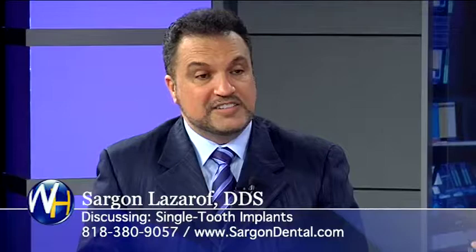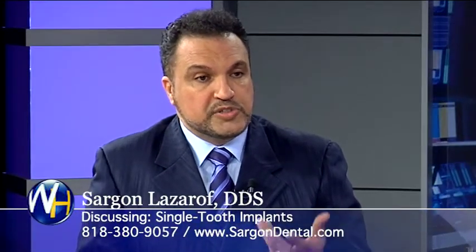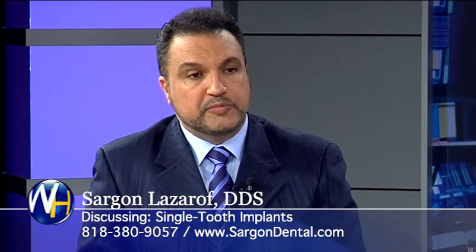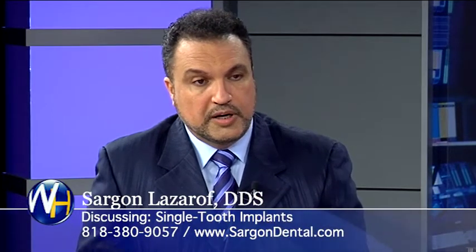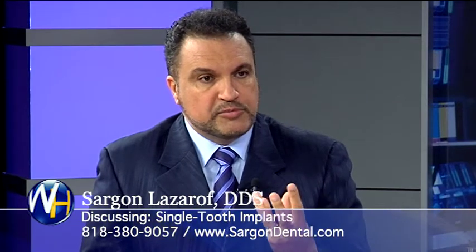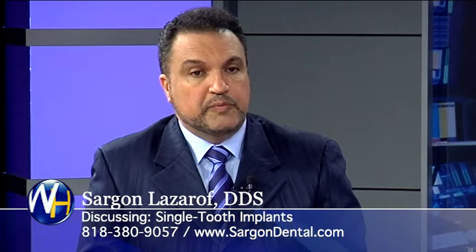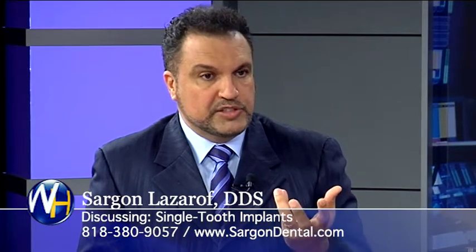Now, this is your expertise. I guess you invented this immediate tooth replacement, single tooth implant 25 years ago. Yes. Prior to my invention, the option was a screw that you have to wait for months for the bone to grow and osteointegrate, attached to it. My invention was this expandable screw that we placed right away and expanded and locked it in bone. And by doing that, we can place a crown on it right away.